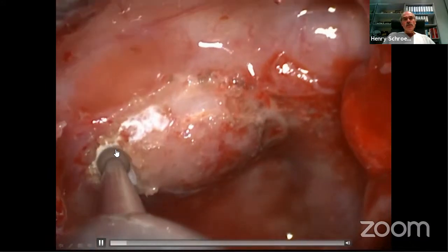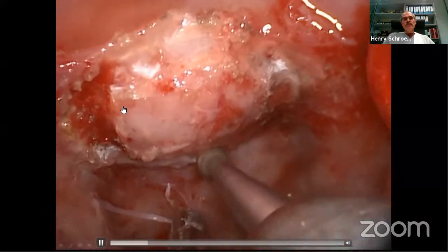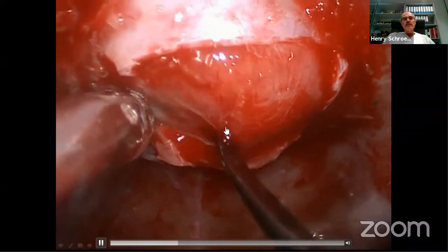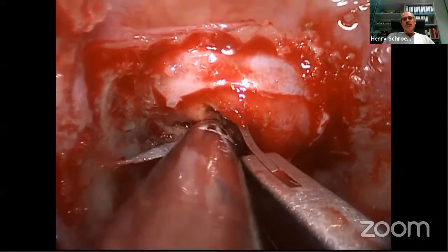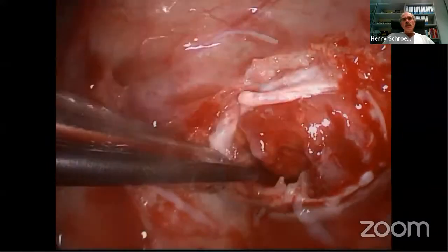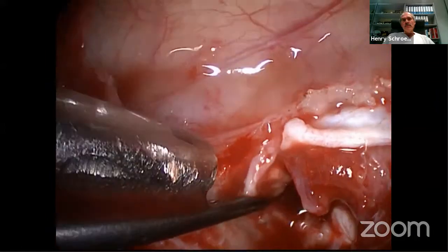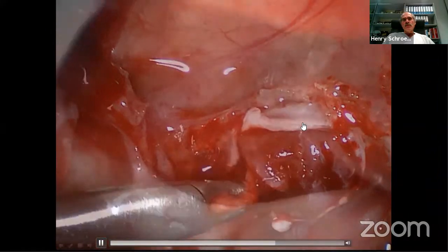So what I like to do is remove the bony sellar floor as one piece, and I take care that the longitudinal axis is longer than the vertical axis. We open the gland to see the tumor. Usually we try to find a pseudocapsule, but frequently in these small adenomas it's not possible. Here in the end, we have a kind of pseudocapsule where we can go around. So the tumor is removed and you see there is no CSF leakage.